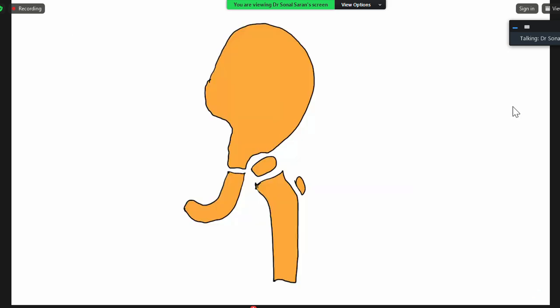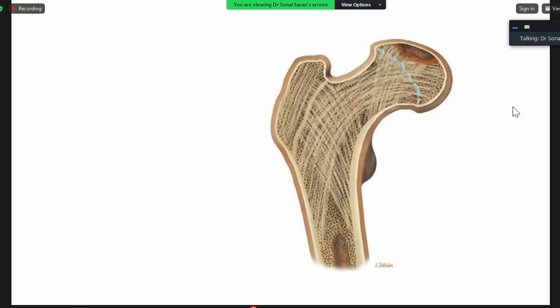What happens in Legg-Calvé-Perthes disease is basically avascular necrosis of the femoral epiphysis. It can lead to reactive joint effusion, which can lead to distension of the capsule and widening of the medial joint space. It can lead to a crescent sign on radiograph, and it can also affect the metaphysis. There can be widening of the epiphysis, and there can be some osteolysis over the medial aspect of the metaphysis, and widening of the neck of the femur.